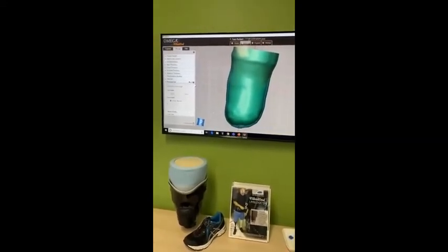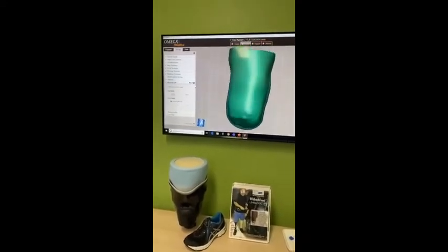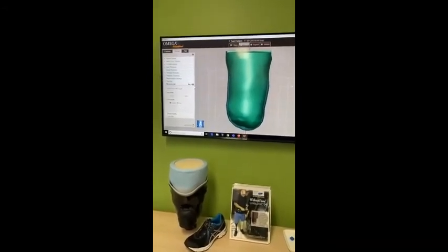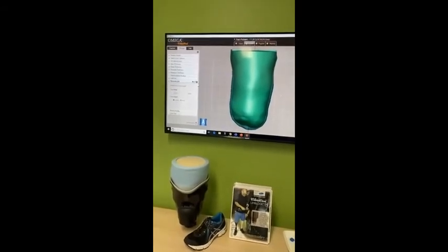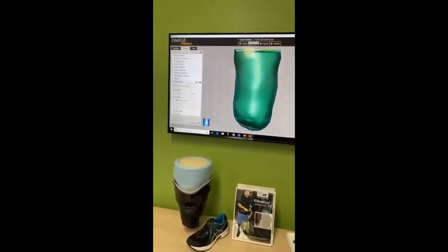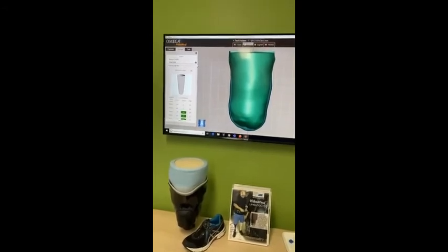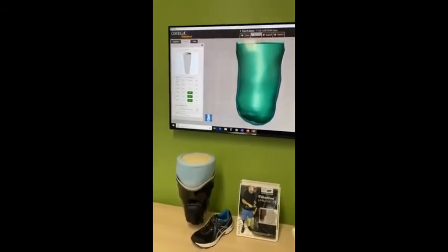So we're guided by you with what modifications you want for your patient and what you would think would work. If you want us to design the liner, we follow your notes that you send in the online form or the PDF form that you email through to us. So again, once you're happy, you review the liner, we look at the liner size, and then we confirm the umbrella size.